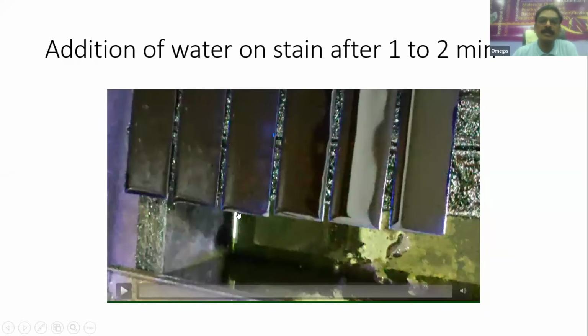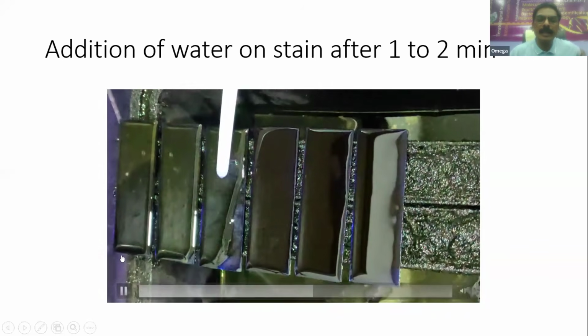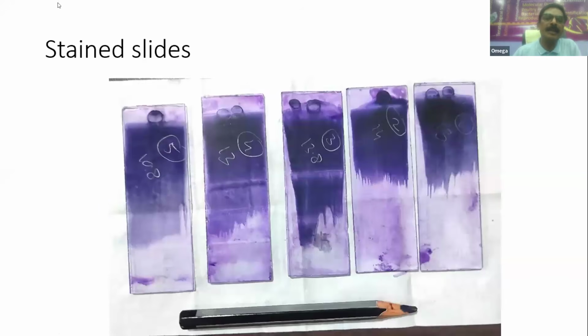So after 1 to 2 minutes, again you have to give, we have to put the water. So like this, we can put the water and allow it to react for 10 minutes. After 10 minutes, our slides will be ready, and you can see that whatever markings we have made over the slides have remained as they are. So nothing has happened to those marks.